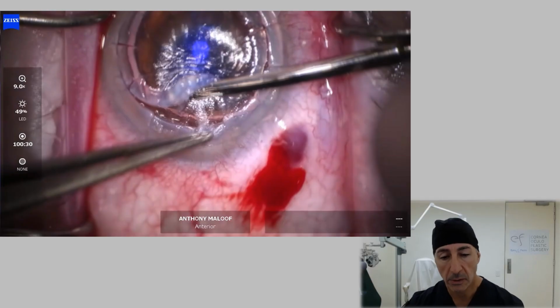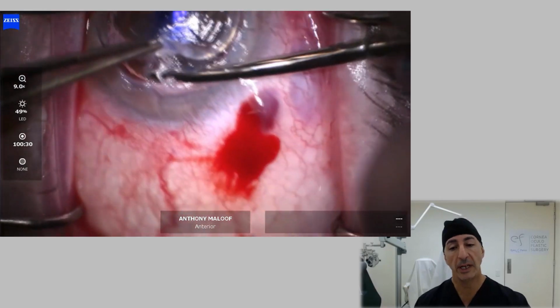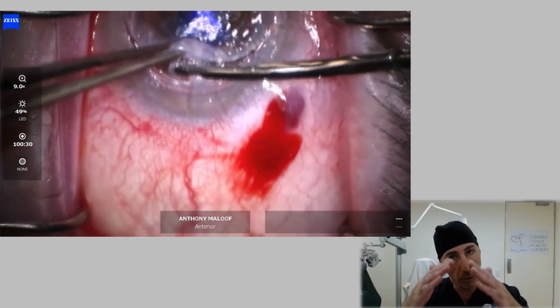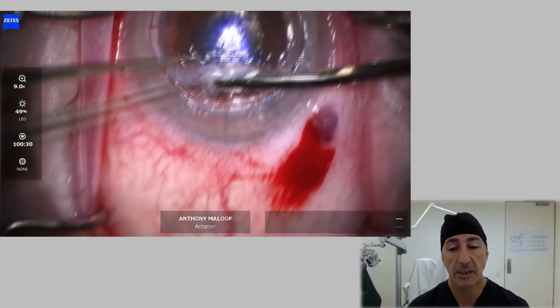The difficulty in radial keratotomy is this: the whole cornea is weak. You've got to stitch a healthy cornea into a weak cornea. And I'll show you that. You'll see it here in the video. So let's have a look. Here we go. So we'll start this up. And here you see the dissection. Note the little incisions that are radial, they're going out, and it looks like a pizza pie, and that's exactly what it is. It's a pizza pie.